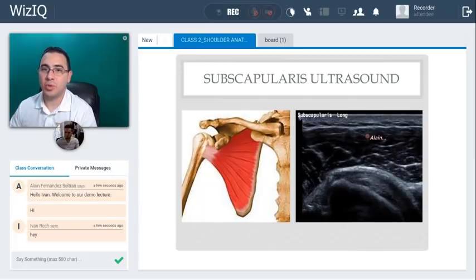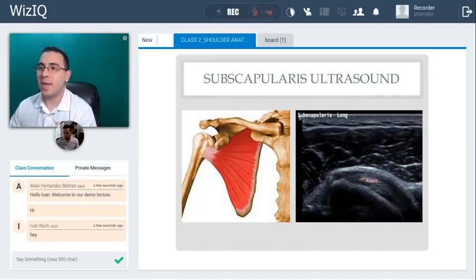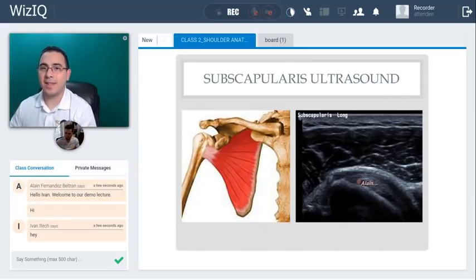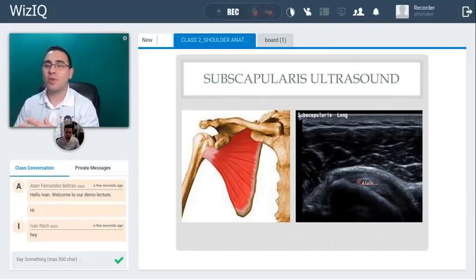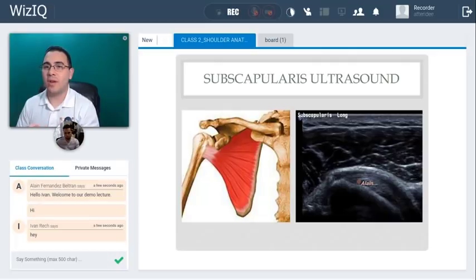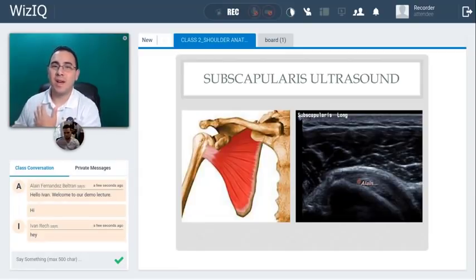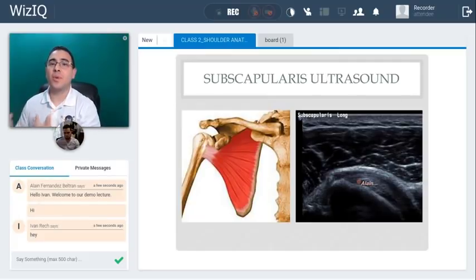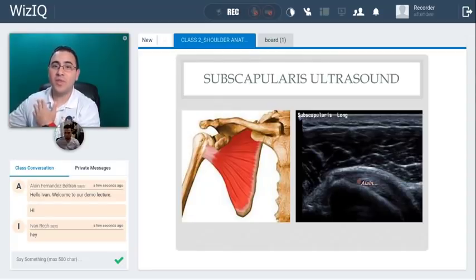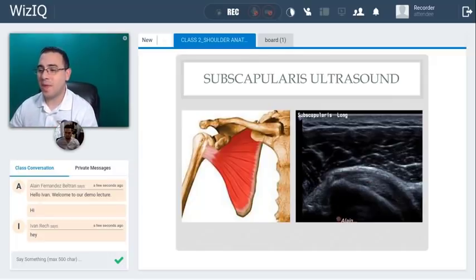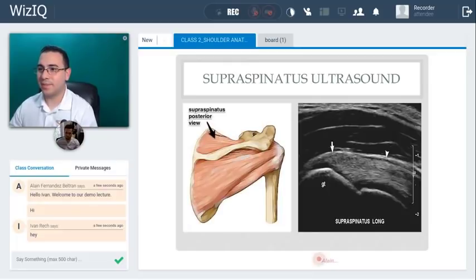In the lectures we're going to learn which muscle is visible up here. This is the tendon, and those are the fibers — if you have a high-resolution system you can see the fibers clearly. We check these tendons in long and short axis all the time. Sometimes you see tears in short axis that you don't see in long, or vice versa. Recent studies say ultrasound of the rotator cuff is as effective as MRI and sometimes more so, because it is quick, easy, and you can compare side to side right on the spot. You can also ask the patient to perform different motions to help find the problem.